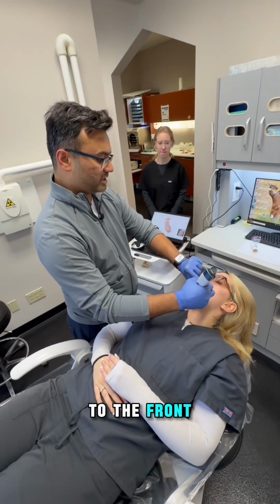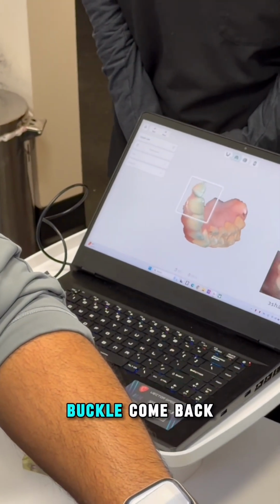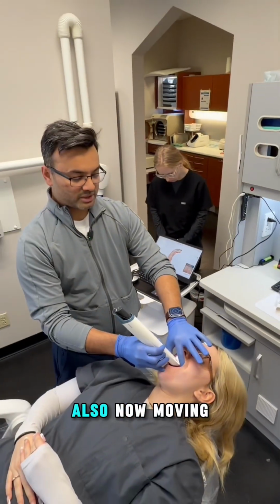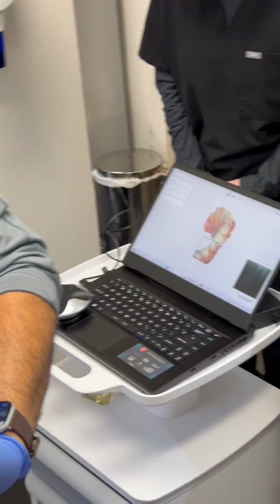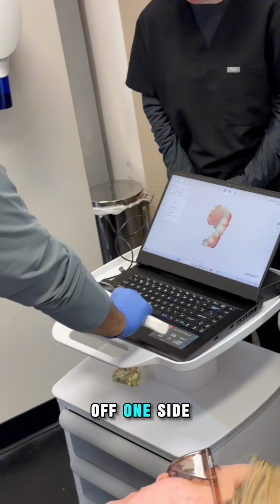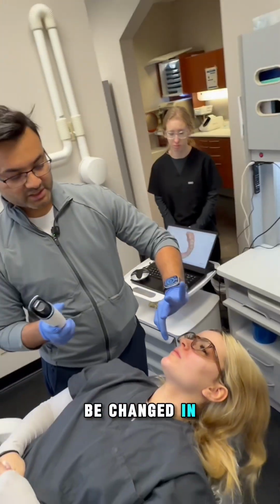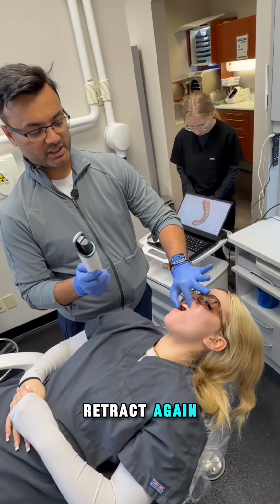I'm going to go to the front, buccal. Don't move all the way buccal. Come back, go lingual. Now I am also moving to the other side, lingual, buccal. If you need to reset, stop, pause, check that scan. I got a very nice scan of one side of the patient's mouth. Nothing needs to be changed in it. Open wide, remember where you stopped, retract again.